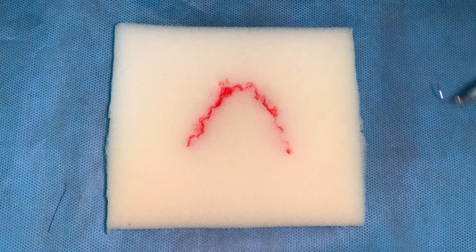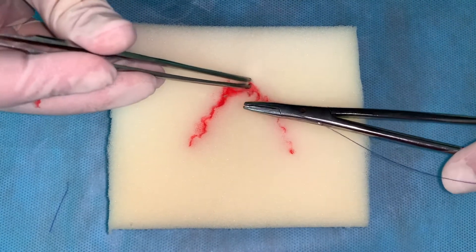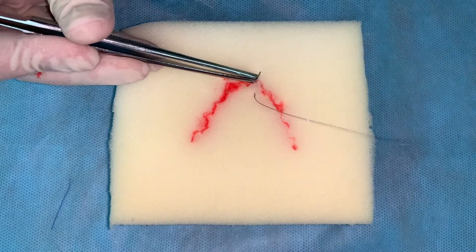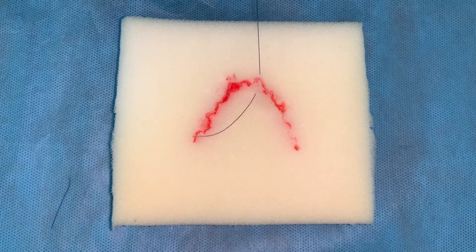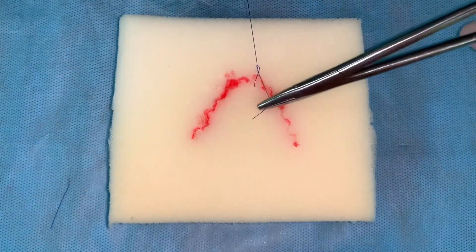To apply stitches on the skin, we use polyamide suture. A needle holder presses the needle with suture, making a prick in and out at equal distance from the wound edge and the same depth, perpendicularly to the wound line. The knots are located on one side from the stitch line. Suture is cut down, leaving 0.5 cm from the knot.